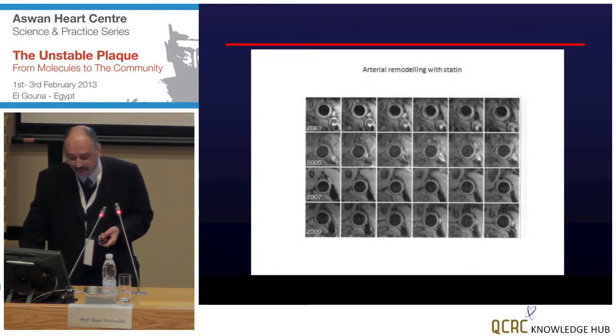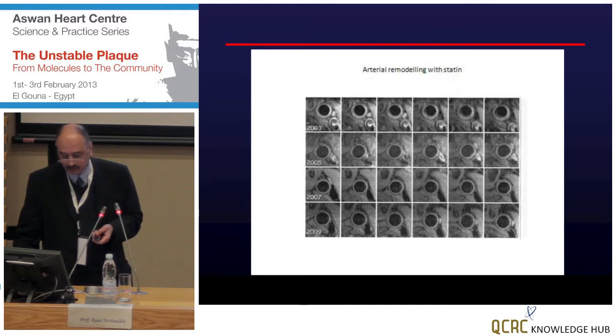This is the same patient I showed you earlier, but with frequent follow-up. And that's the beauty of MR, that you don't worry about X-ray radiation or any safety issue. You can follow up the natural history of the atheromatous lesion like this. That's before treatment, and that's following treatment. You see definite regression in the arterial wall thickness there.